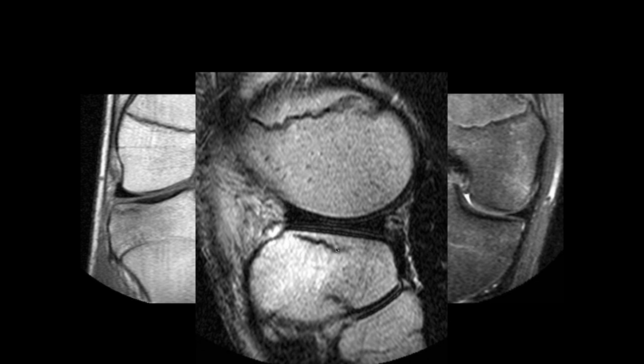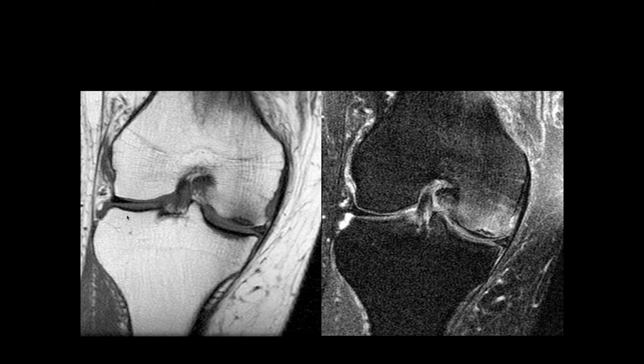That looks like a varus injury. Wait a minute. On which side are we on? This is the lateral side, so it'd be more of a valgus type. Wow. Yeah. Okay. Good. All right.